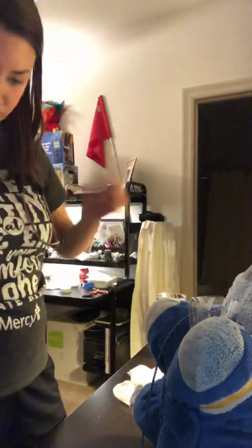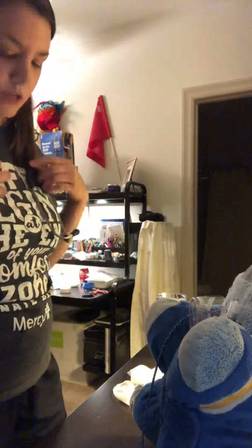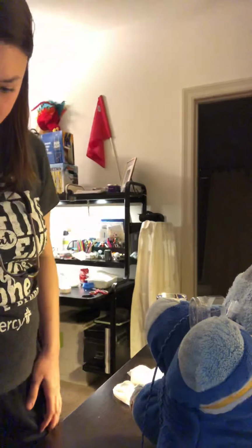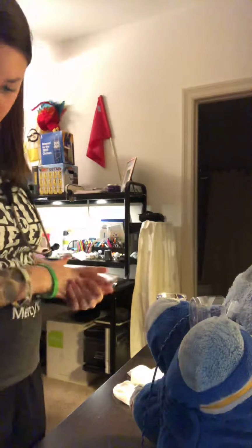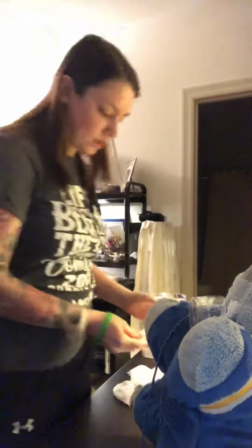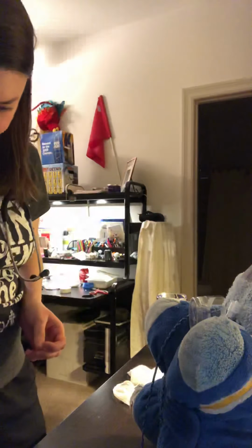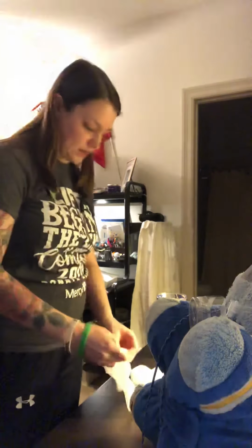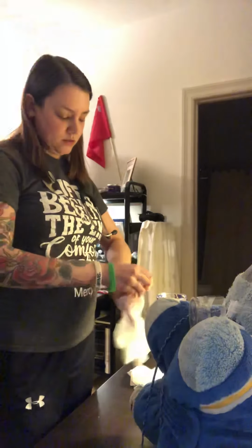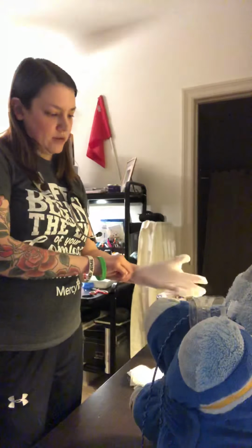Be the suction portion. So now I'm going to move on to tracheostomy care, which would be a dressing change and cleaning the inner cannula. So I'll get all my stuff together, perform hand hygiene, and open the kit at the bedside, but my kit's already open, so I have my kit here. I'll put sterile gloves on my non-dominant hand first, which I don't have any sterile gloves with me, so I'll put it on my left hand here.